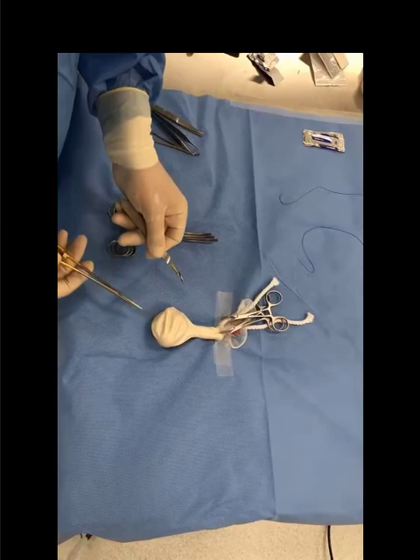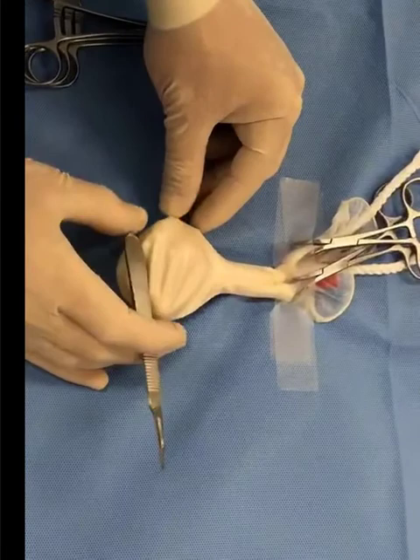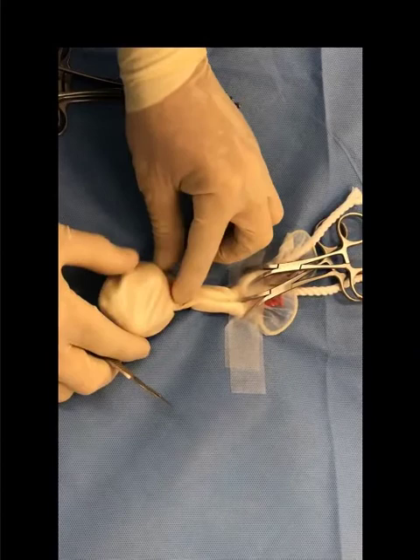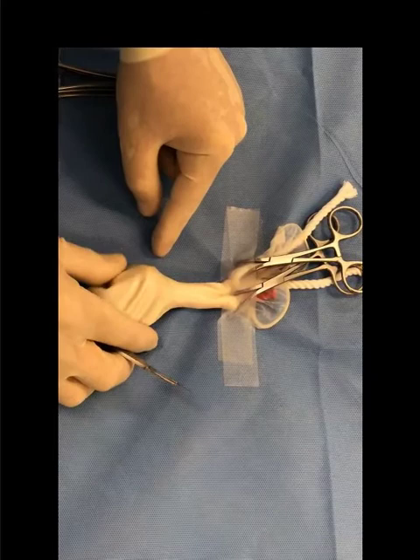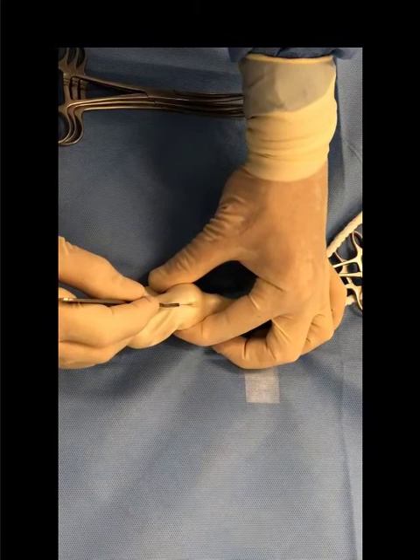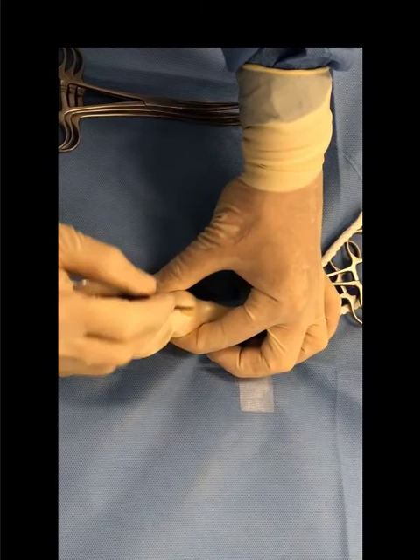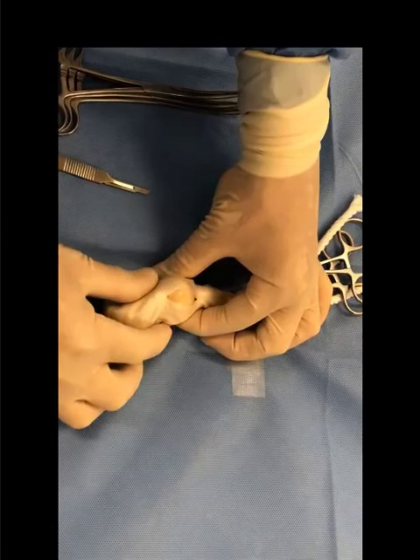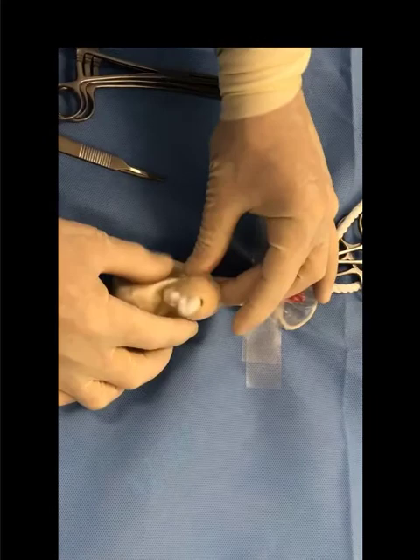With the canine castration we're going to do a pre-scrotal incision, so we want to be able to bring the testes up into that pre-scrotal position. It's important to develop a sense of where that incision is going to be. With one hand bring up the testis to the pre-scrotal position, with your non-dominant hand stabilize the testis, and then make the incision directly over the testicle. We're just going through the skin — we don't want to go through any deeper layers — and use the tension to help as we cut through. Once we're at that point we can bring out the testis, and you'll see the testis is within a tunic.